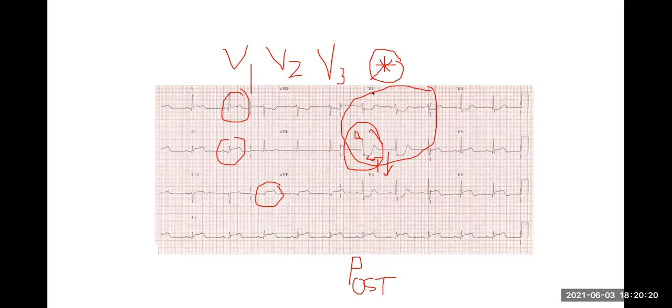So essentially this is difficult to catch, but that is a posterior STEMI. This ECG is an inferior posterior STEMI.